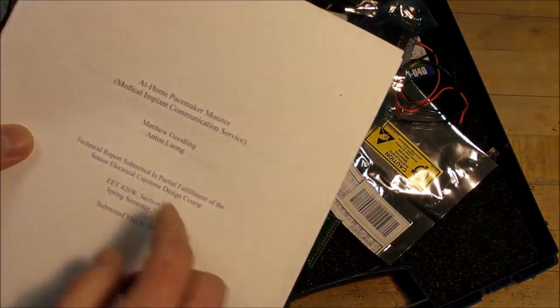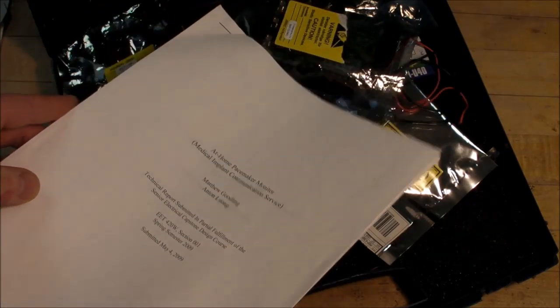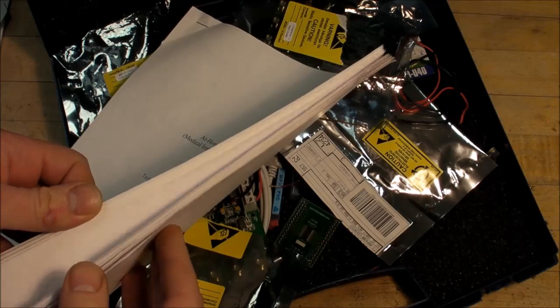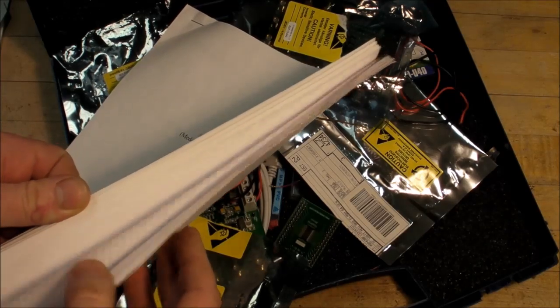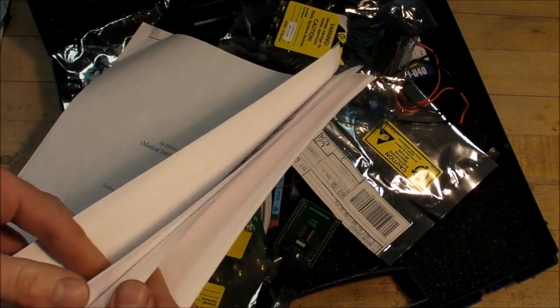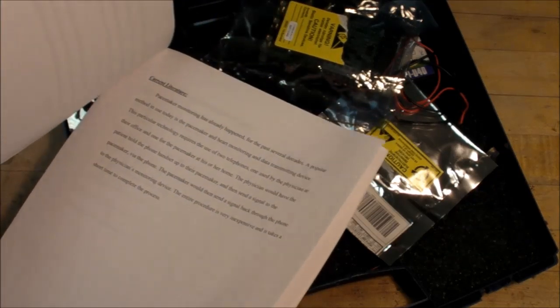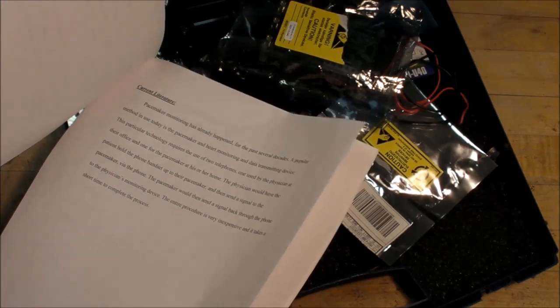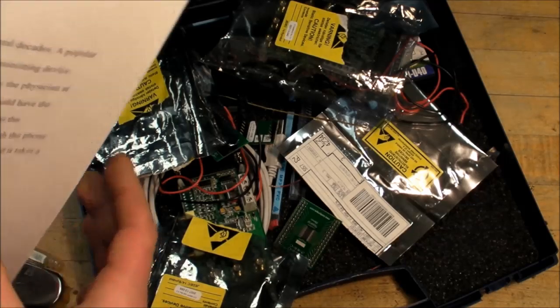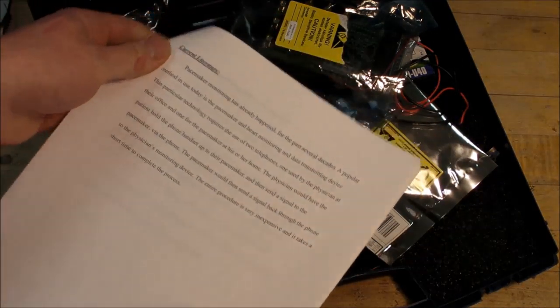Basically, the focus of their project was to have an at-home pacemaker monitor, something that would communicate over the internet, over email or something, and then it would email the doctor, and the doctor would have status of the pacemaker while the patient is comfortably at home. Just hook up the sensor and transmitter doohickey thingamabob. I don't think they ever actually built one.